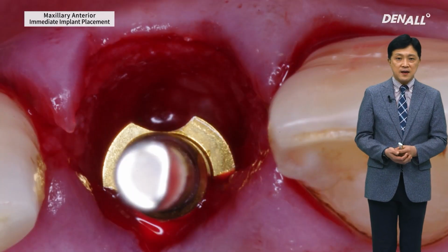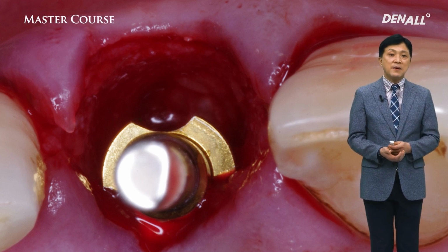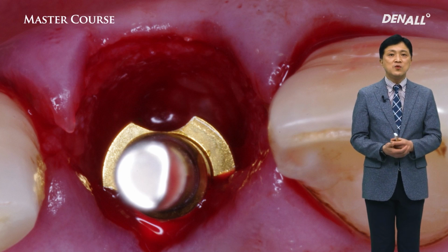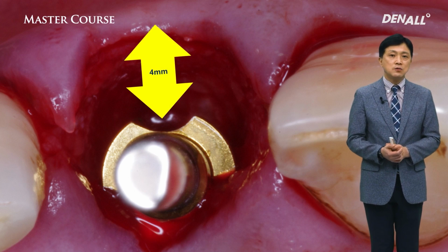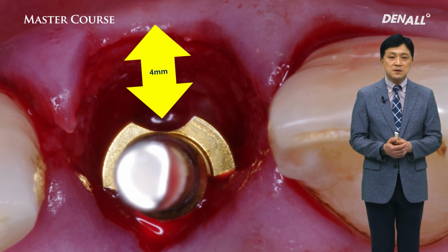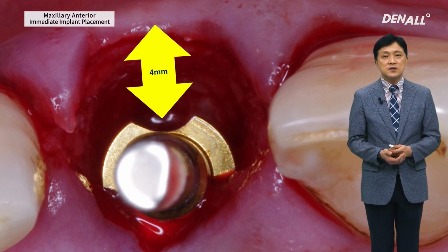Then, how much gap in the labial side should be made? In my view, according to many literature, 4 millimeter gap is considered stable. If it is less than 4 millimeters, I will explain it later, but it will require other procedures.